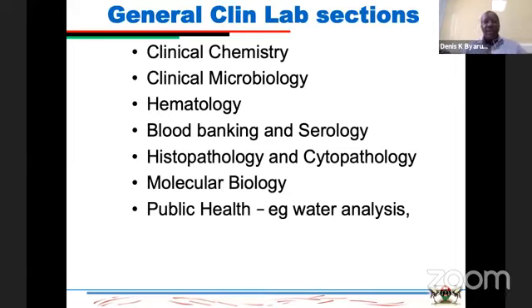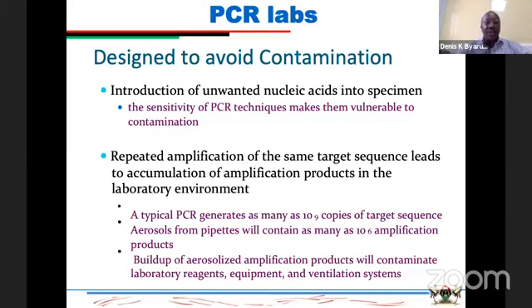You may realize that even within COVID, besides virus detection, you may find yourself engaging in other sections of the lab in order to give a more comprehensive evaluation of patients, either by doing other clinical chemistries or histopathology or other areas that might be required to support the management of these patients. But for today, we'll be focusing on PCR labs and how these are set up and how they are managed.